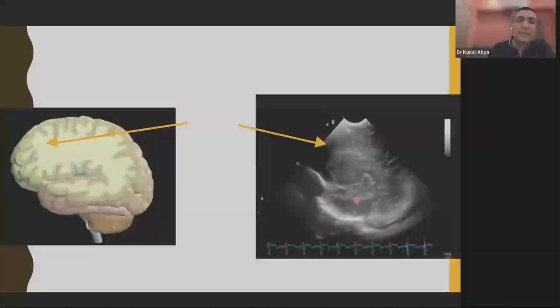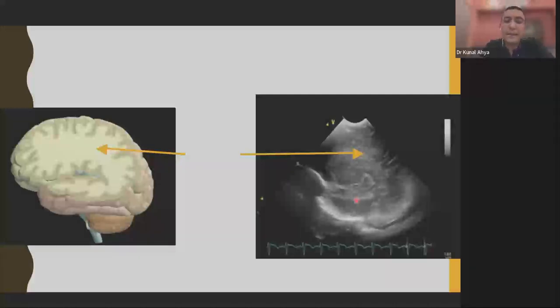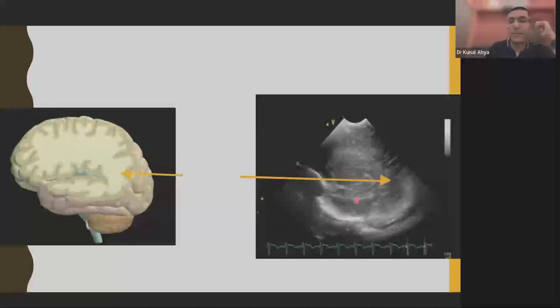So here is the frontal lobe. Then what is this lobe, which is the central part of the brain? Which lobe, frontal, occipital? Yes, this is the temporal lobe. Sorry, parietal. No, this is not the temporal. This is the parietal lobe. Posteriorly is the occipital lobe. And below the sylvian fissure is our temporal lobe. So all of this structure you can see over here is the temporal lobe. The front part is the frontal lobe. The central part is the parietal lobe. The posterior part is called the occipital lobe. And the lower part below the sylvian fissure is our temporal lobe. And this is our cerebellum.